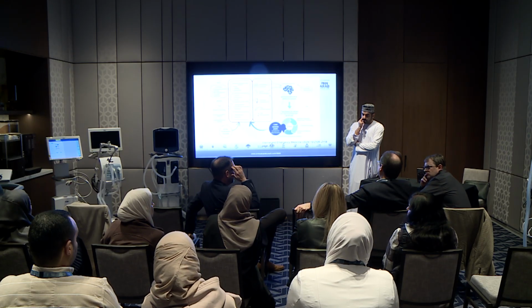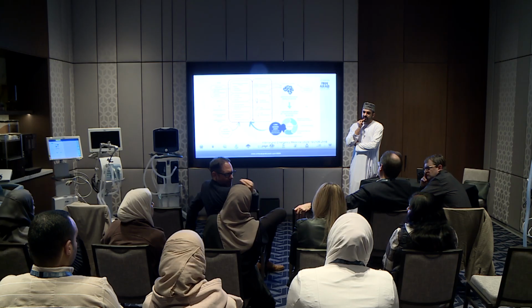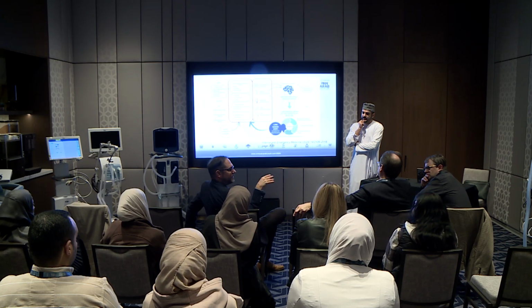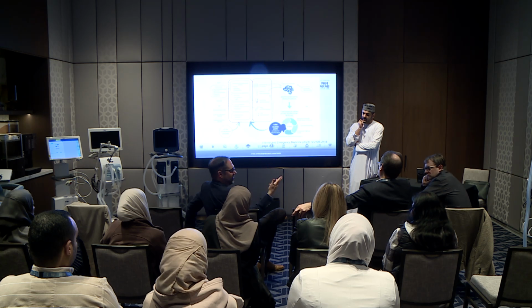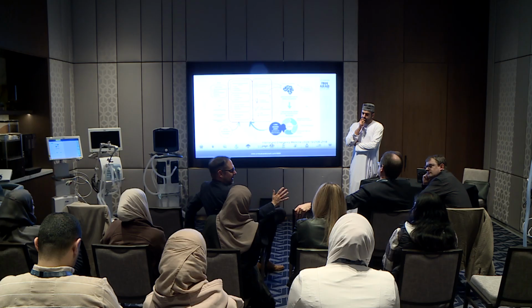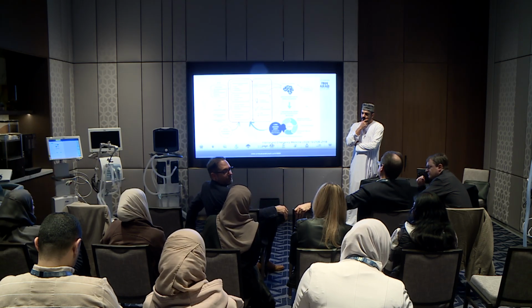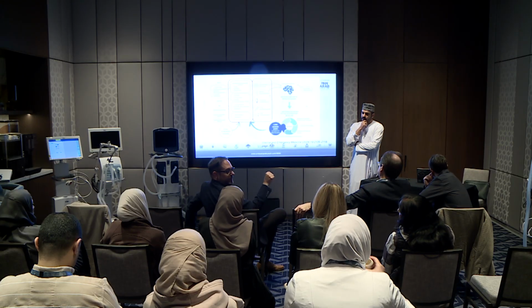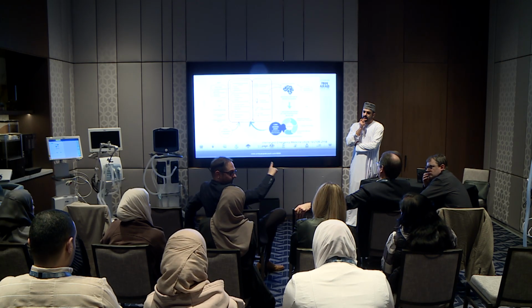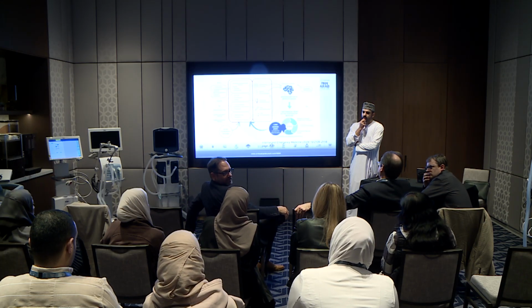But the other thing that's important is not to instruct them. If you tell the patient what you're doing, it's not like a NIF where you want them to take a deep breath. You don't tell them. You just say, I'm just going to do some measurements here, and then you don't prompt them. You do the maneuver, and as soon as it stops, they might look at you, but they're breathing fine now. You do three and take the average of the three, but you don't hold it and take three breaths in a row, because as Lorenzo pointed out, in some patients it will get stronger. In patients that are very weak, it may get weaker, so it confuses the value.